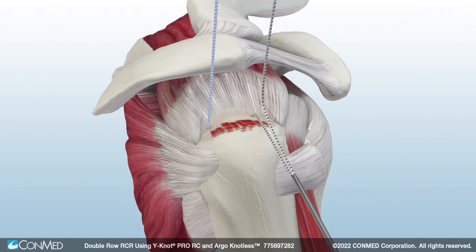Use the Spectrum Auto Pass to pass all four suture limbs from each anchor through the remaining rotator cuff tissue.